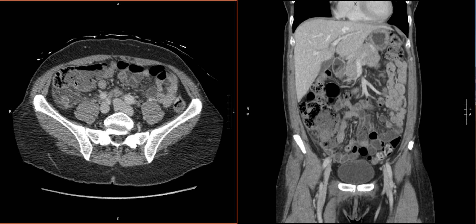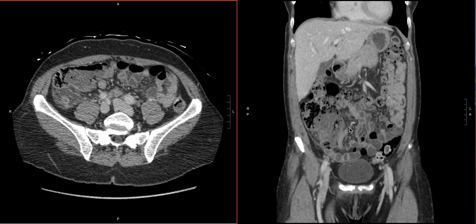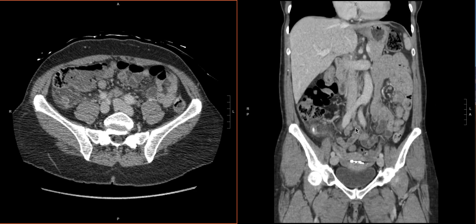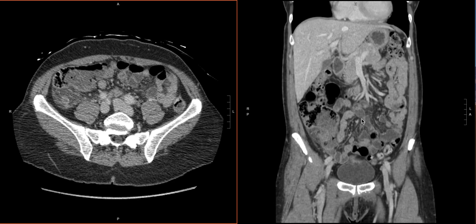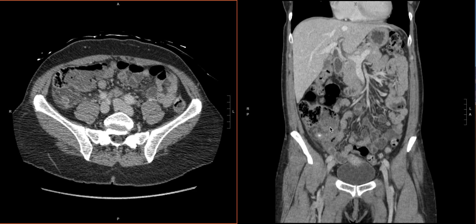Here on the axial, it's a little hard to see the ileocecal valve, but if we come to the coronal, we can see the fat in the valve right there. Scrolling back and forth to confirm — this looks to be our ileocecal valve, and as we scroll, this is actually terminal ileum, which plugs into that valve, into the cecum right there.